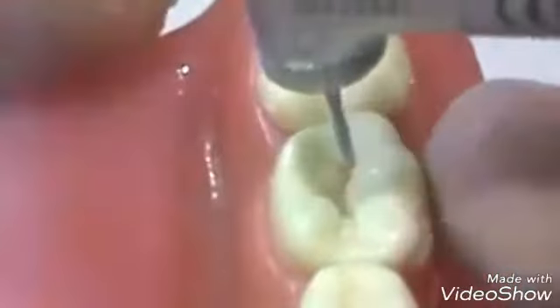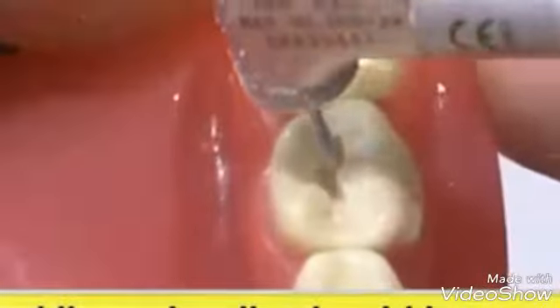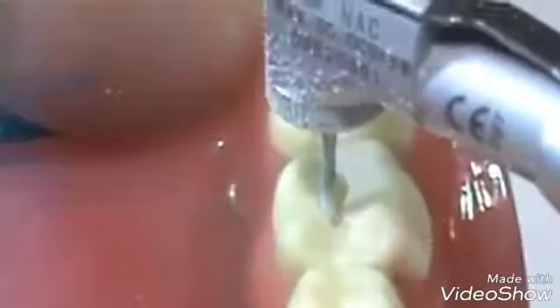This is done by tilting the fissure bur and cutting under the cusps, both the buccal and the lingual cusps.